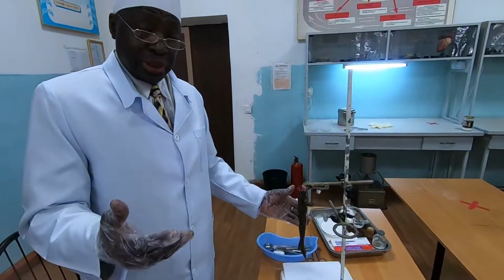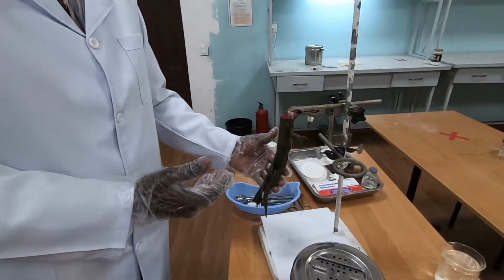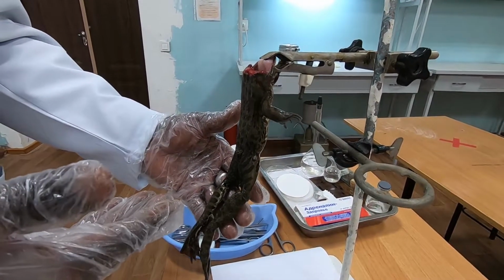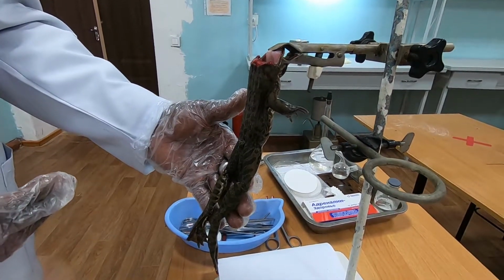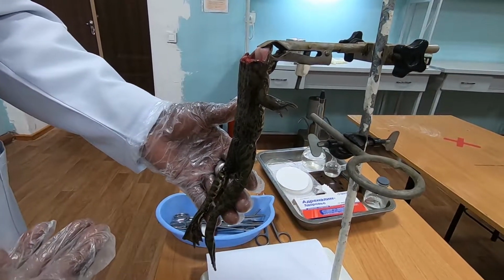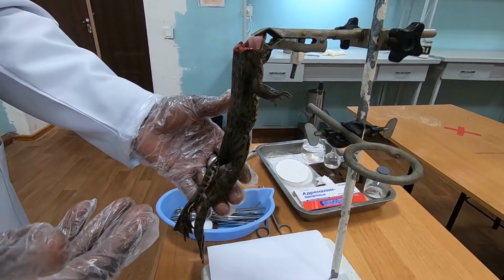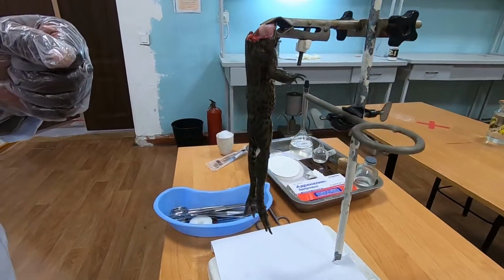So, students, with what we have seen, the frog has regained its reflex reaction, because the shocking condition has already passed. It has already passed the shocking condition, and now it has regained its reflex reaction. That's why you saw it shaking.